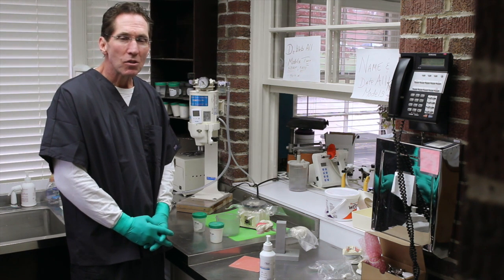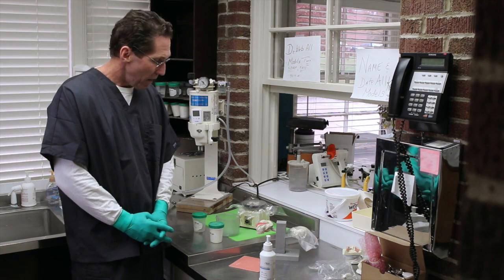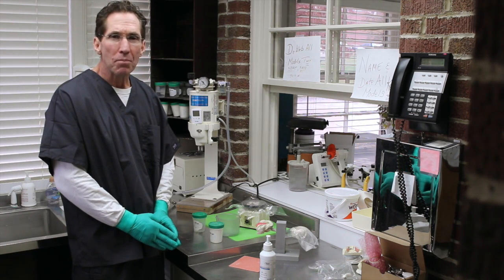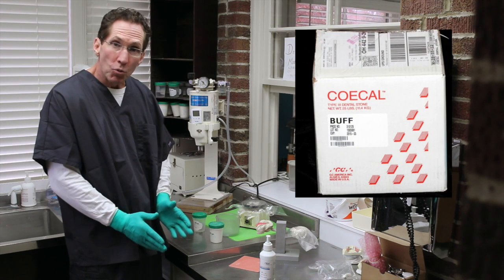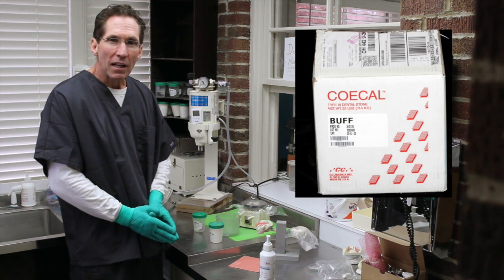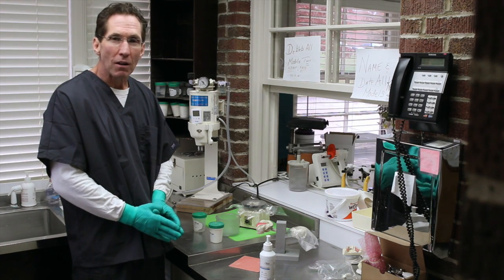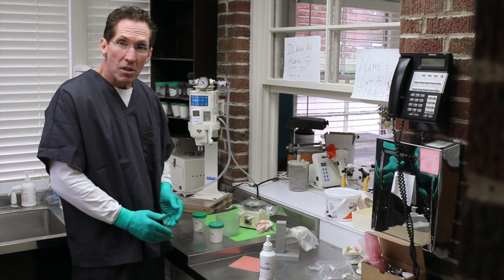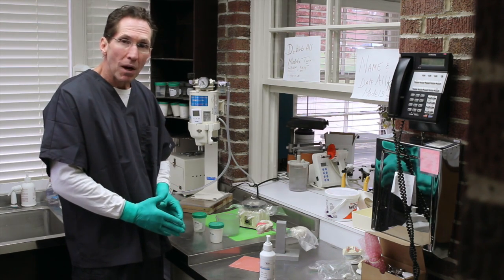Okay, now let's pour an excellent impression here. And as we described earlier, our recommendation is to use the Kocal Type 3 buff stone, for two reasons. One, because individually it's an excellent material, excellent stone. And secondly, because of its high compatibility with our alginate, the gel tray regular set. And so for that reason, we are going to use the Kocal, again, Type 3 buff stone.